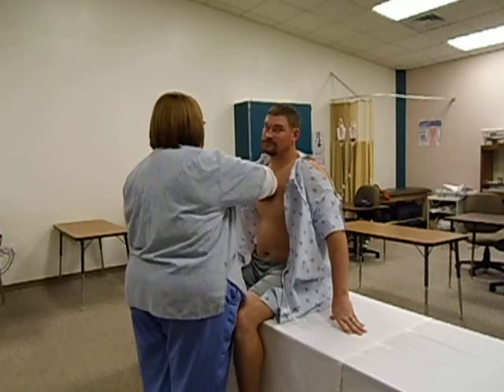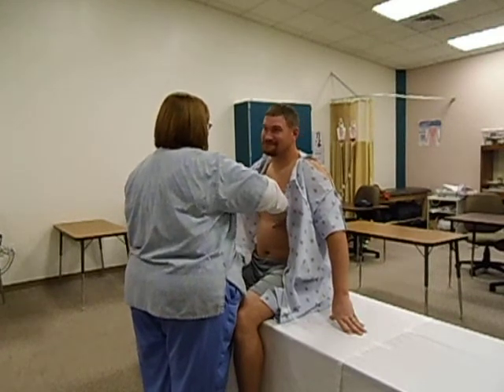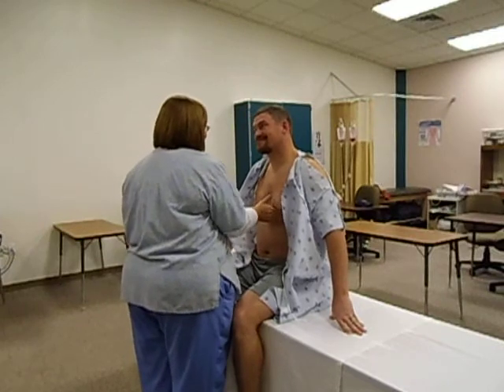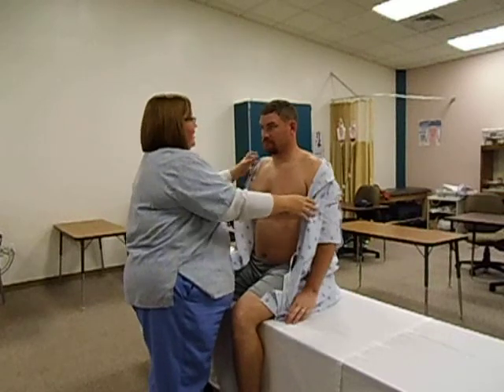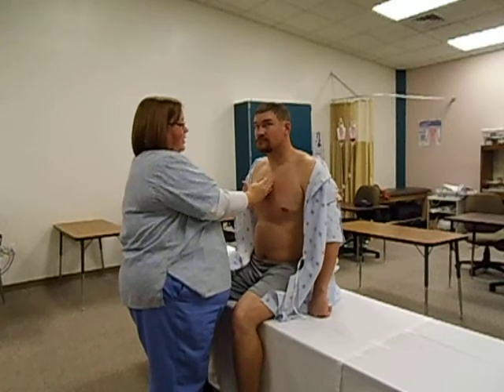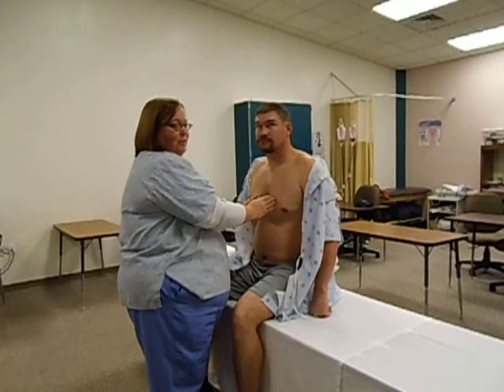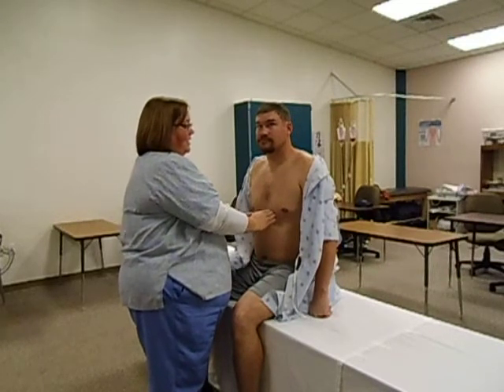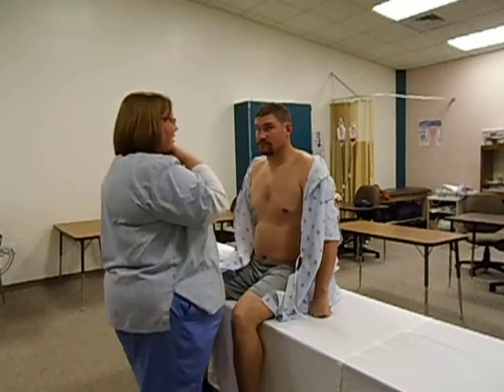No. There's no crepitus noted. So at this point, I will auscultate the breath sounds. I'm going to begin with the anterior breath sounds. I'm going to start in the vesicular area up top, moving to the bronchial breath sounds, which are heard over the trachea, and then into the bronchovesicular breath sounds, which are heard over the main bronchus, and then again to the vesicular breath sounds. And I'll be auscultating from the anterior and posterior sections.